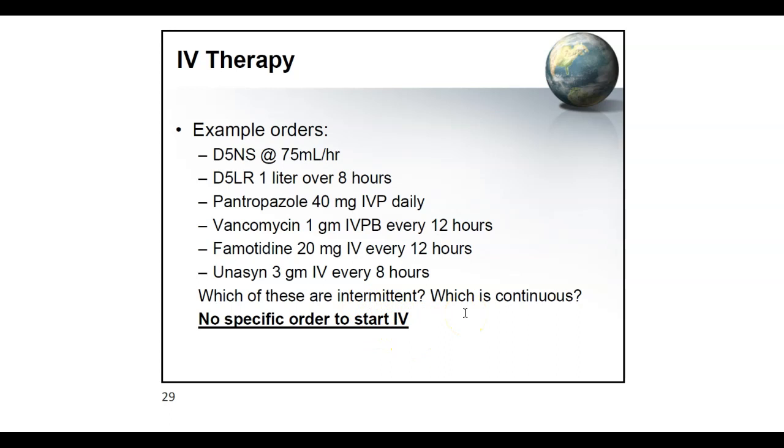So if you have an order for this medication, as far as what I learned from working at the hospital, once a patient gives consent to be admitted to the hospital, part of it is having an IV started if needed. Now this is just for peripheral IVs. If they need a PICC line and other stuff, the more invasive and bigger types of IVs, the central lines, then they need to have a separate consent. But for regular peripheral IV, that's usually part of their admission consent. So you don't have to get an order to start an IV before you start an IV, especially if you have this ordered, right? How else are you going to administer your medication?